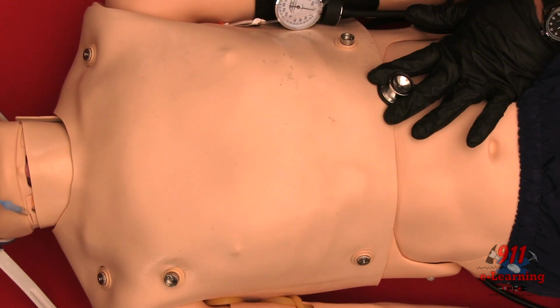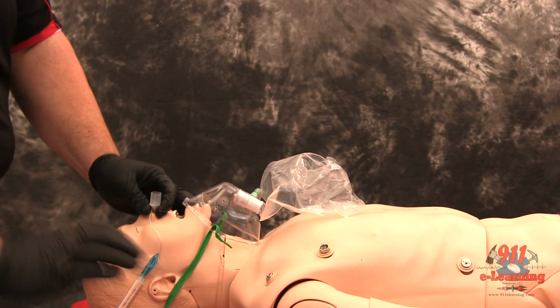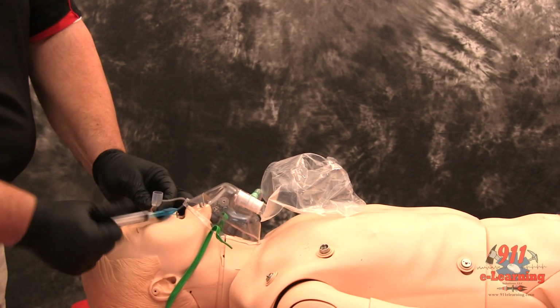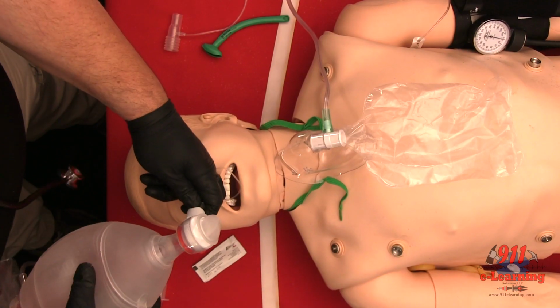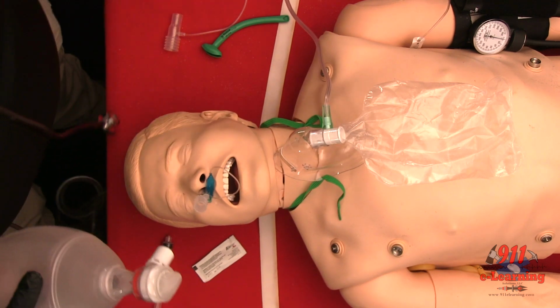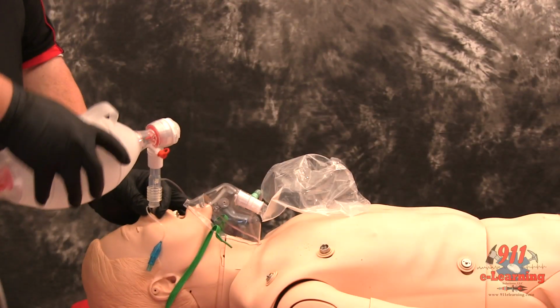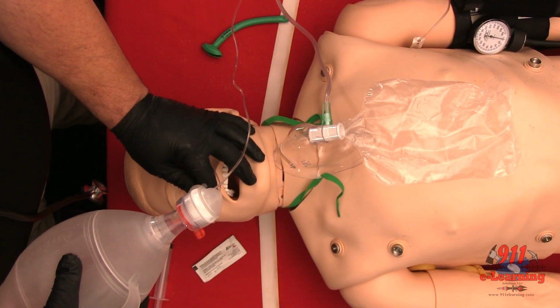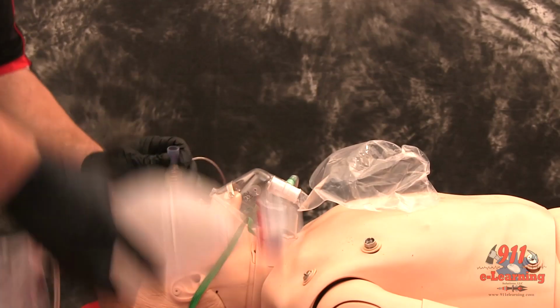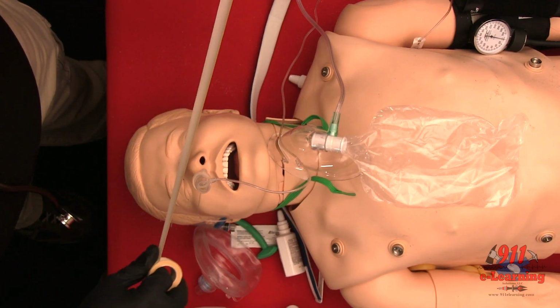The 15mm adapter usually rests close to the nostril with proper positioning. Inflate the cuff with 5 to 10 cc of air. Confirm tube placement using an end-tidal CO2 monitoring or esophageal bulb device. Secure the tube.